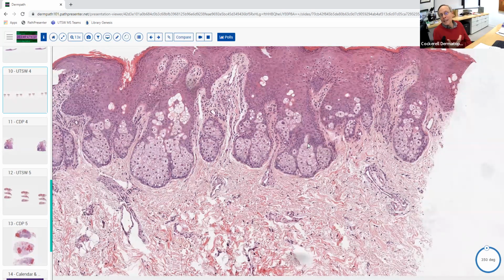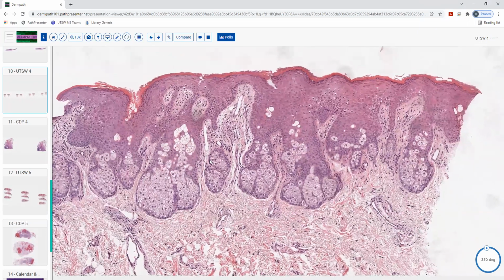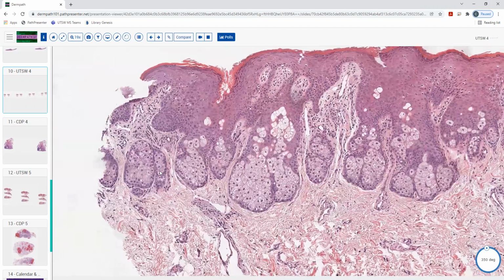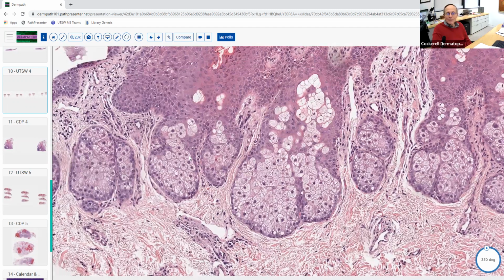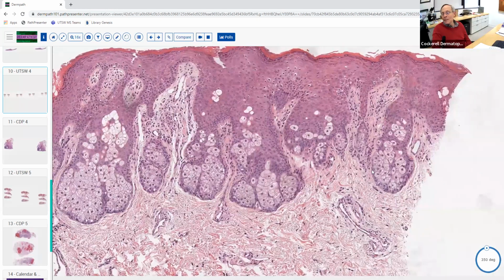Good. Yeah, that's what this actually turns out to be. And those are usually on the lip area. What do they call them when they're on the areola? It's not the areola because they don't have all the smooth muscle bundles that you'd see down there, the erectile tissue. There's Fordyce. I think one of them starts with an M. Montgomery's tubercles. Thank you. Okay. You don't need to know all those names necessarily, but basically this is just ectopic sebaceous glands. Nothing to worry about.